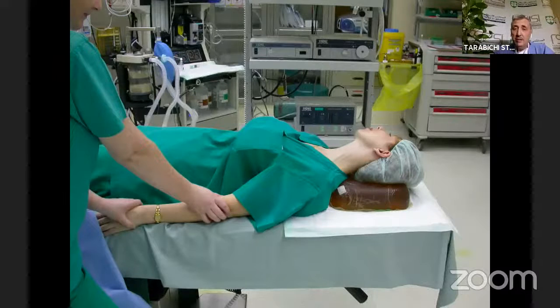And this is what I usually do: I ask the nurses to place the headrest sort of the wrong way, so the head could fall into that area. And I pull on the hand and I use a green towel to fix the hand, tuck the hand in place. So I like the shoulder neck angle to be around 120 or 130. It basically gives you the ability again to turn the endoscope this way and that way and really have a great access into the attic.